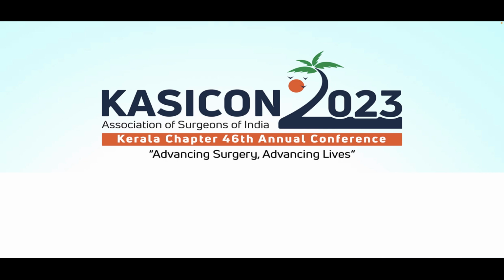A common terminology that we come across, that we have already discussed, is FAST, E-FAST, and another one more is WBCT, full body CT. So can you give the indications for these three? Actually, now the recommendation as per the 10th version of the ATLS is to go for E-FAST for all patients with trauma. Whole body CT has specific indications.